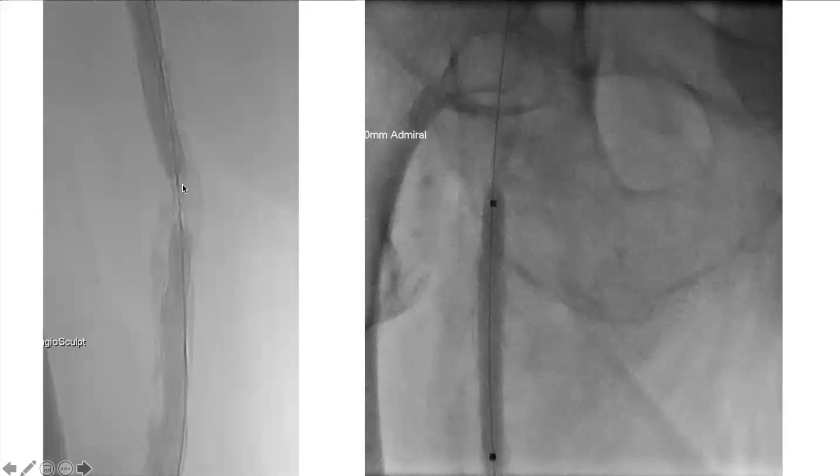Here is after laser, and this is the AngioSculpt again — you can see the nitinol cage trying to open up the lesion. I like to magnify to really see the tight areas and watch it pop open. You go to high pressure — it's really hard to burst these balloons. This ended up with DC ballooning and this is the end result with laser and ballooning.